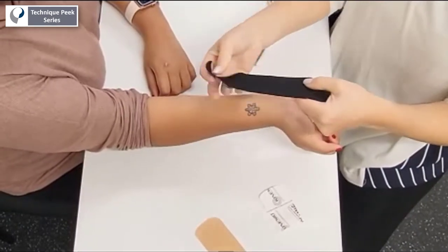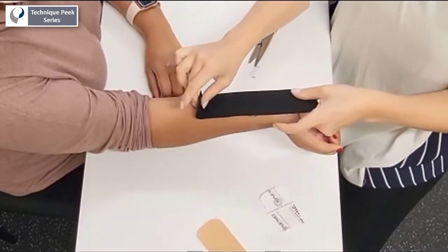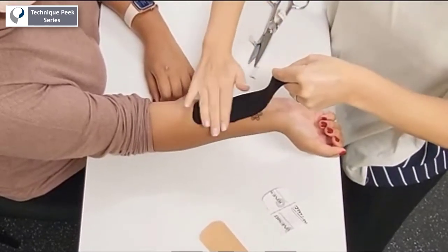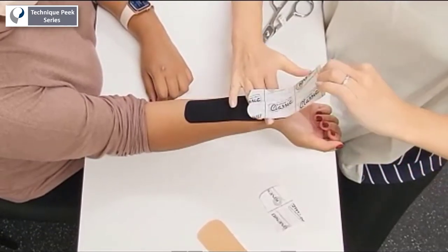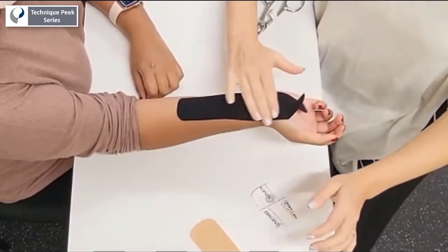First, peel the proximal end of the tape and apply to the skin with no tension. Rub vigorously to activate the adhesive in the tape. With paper off tension, apply the remainder of the tape up to the tails.